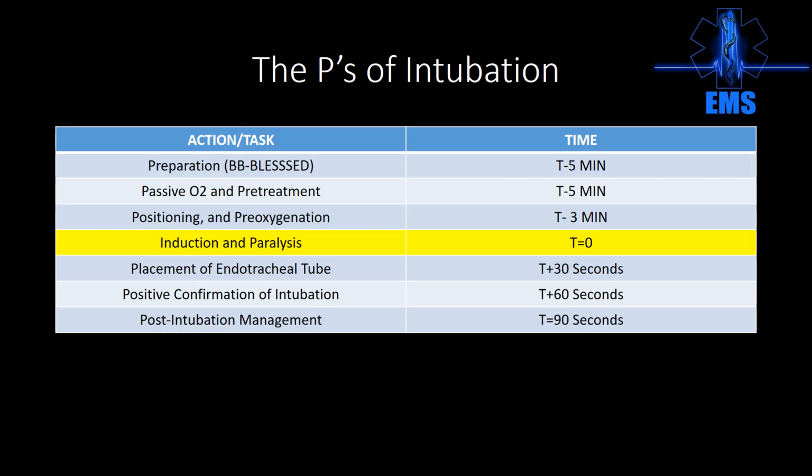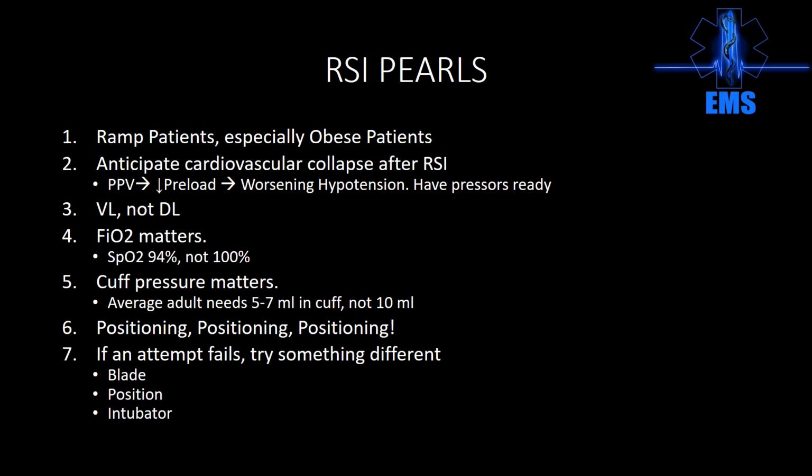And then lastly, post-intubation management. And this is why we pull up the post-intubation drugs, because as soon as the patient gets intubated, we give them a big slug of something so they don't remember it. But more importantly, they comply with the therapy. They don't reach up and pull the tube out. If that hasn't happened to you yet, it's coming.